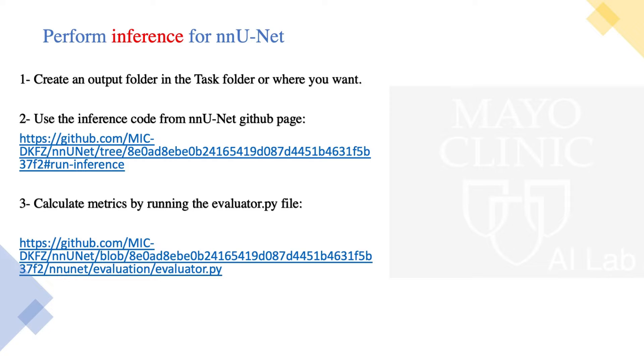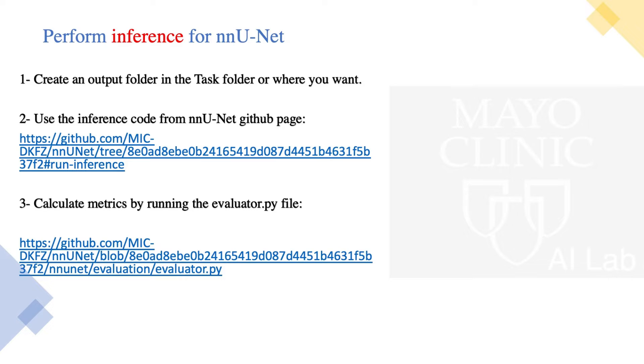Running inference for nnU-Net is easy if we follow these three main steps. First, we need to create an output folder. It is recommended to be in the task folder, but you can put it everywhere that you want. So we want a folder that we put our predictions and computed metrics in that folder, known as an output folder.